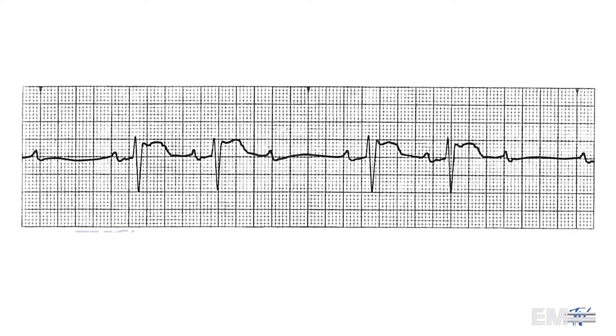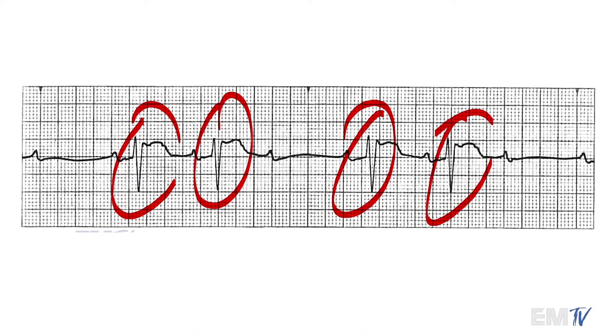As we're looking at six-second strips here, there are one, two, three, four QRS complexes, so this heart rate is approximately 40 BPM.